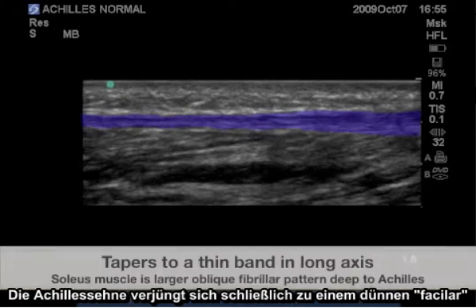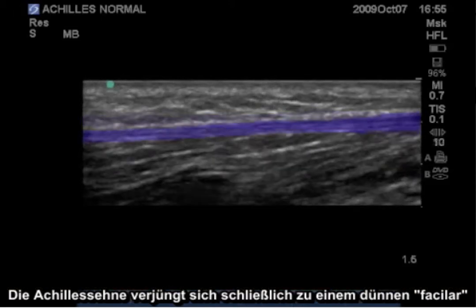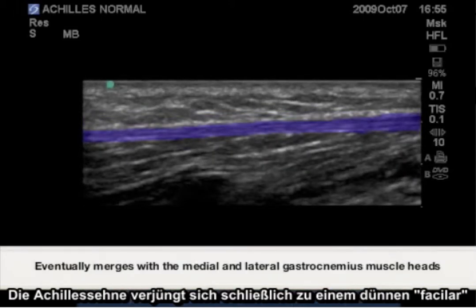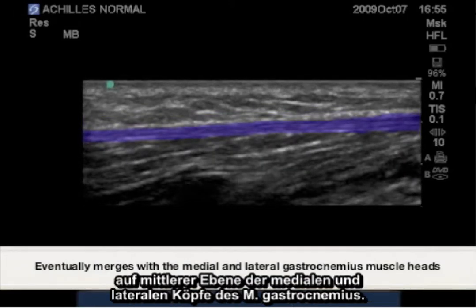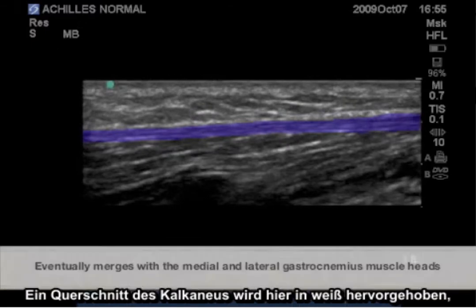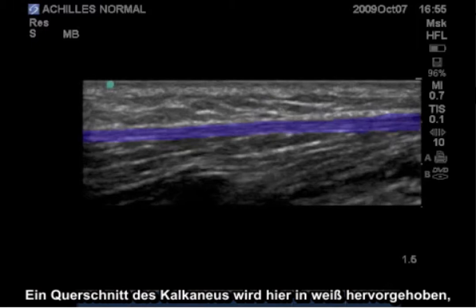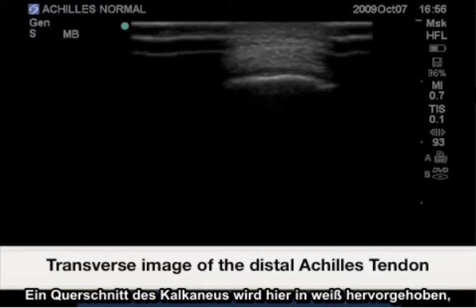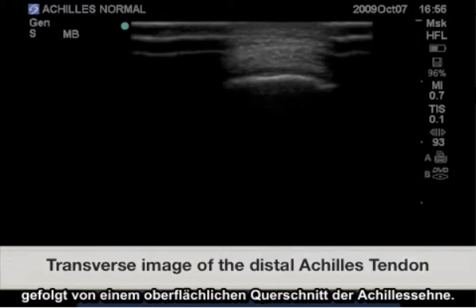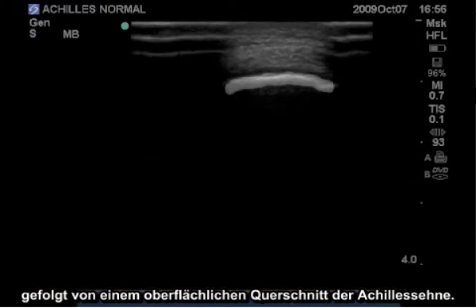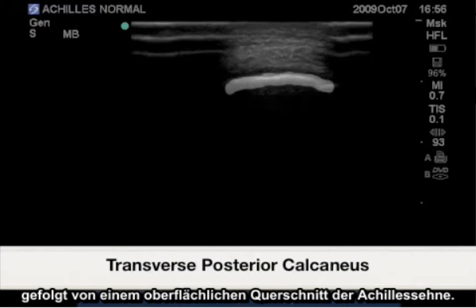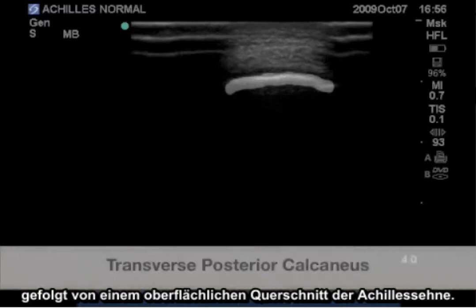The Achilles tendon eventually tapers to a thin fascia layer at the mid-level of the gastrocnemius medial and lateral heads. Here is a cross section of the calcaneus highlighted in white, followed by a cross section of the Achilles tendon superficially.